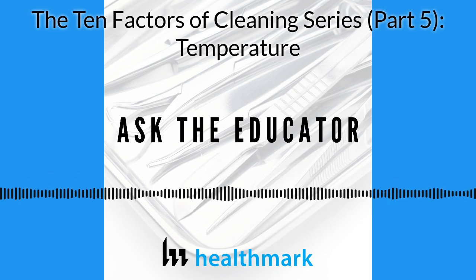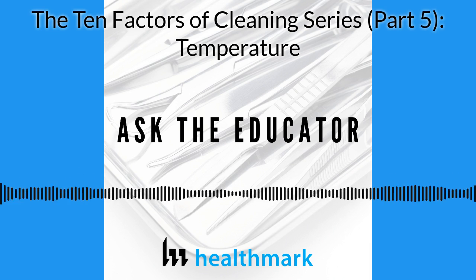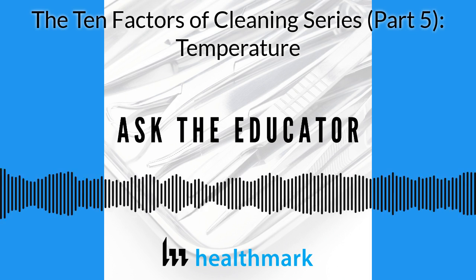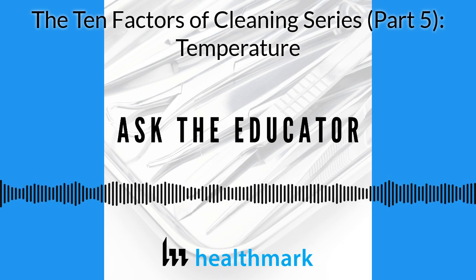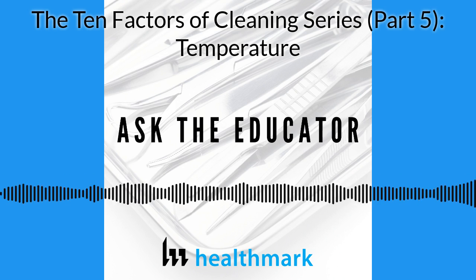Okay, just to recap this episode, Stephen Kovach helped us understand the role that water temperature plays in the cleaning process. It is important to know what the water temperature should be at each stage of the manual and automated cleaning process. If you have trouble passing cleaning verification tests, or worse, problems with dirty instruments, then water temperature is just one of those 10 factors of cleaning that you should check and monitor.